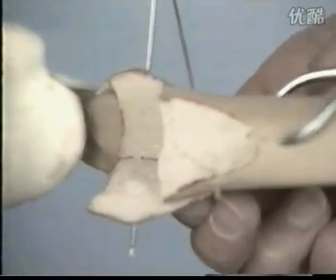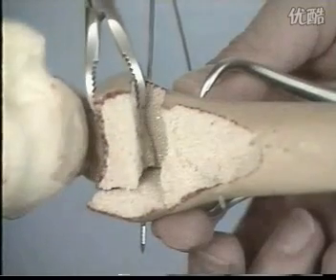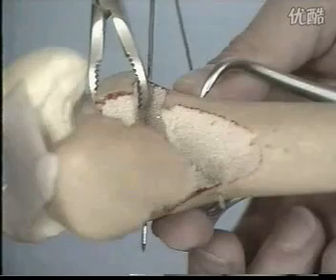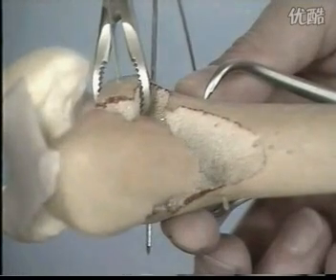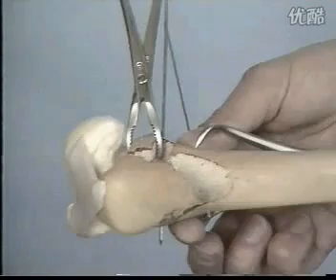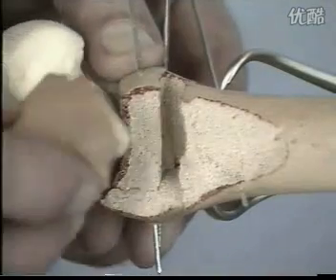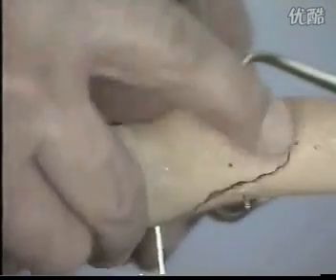Then we reinsert the central fragment, again using the talus as an abutment. AP fixation with a Kirschner wire. Finally, we reduce the tibial malleolus fragment and also fix it with a Kirschner wire.